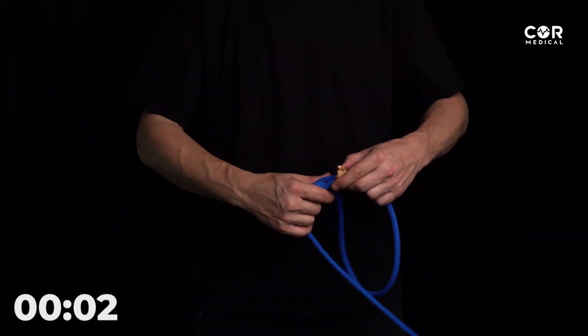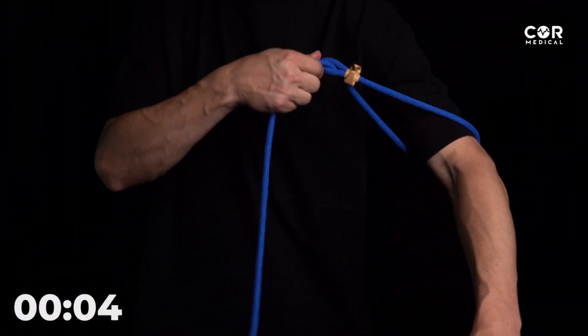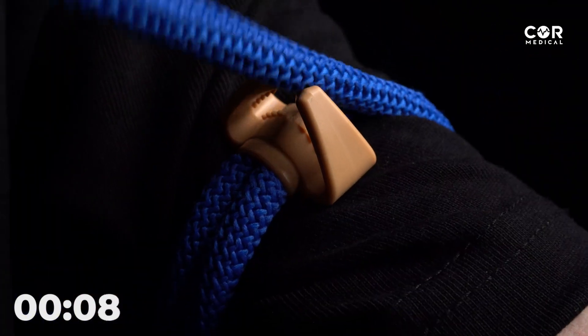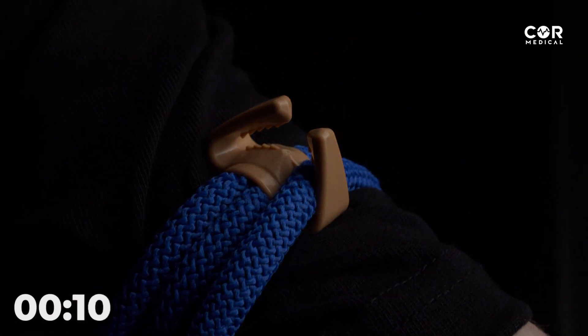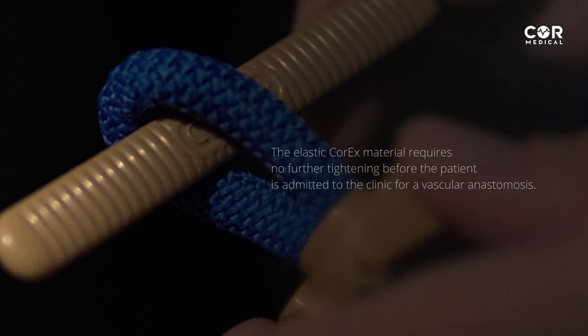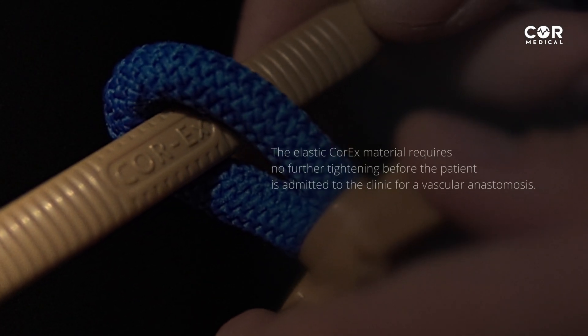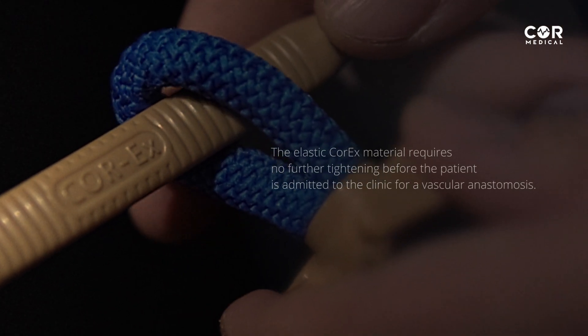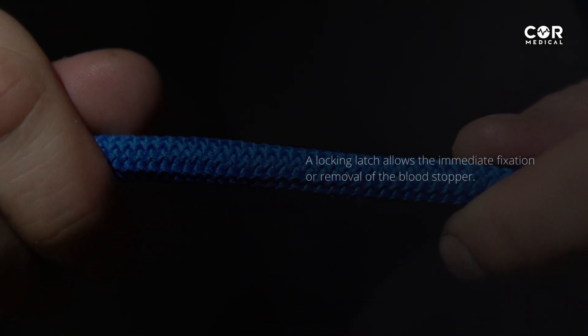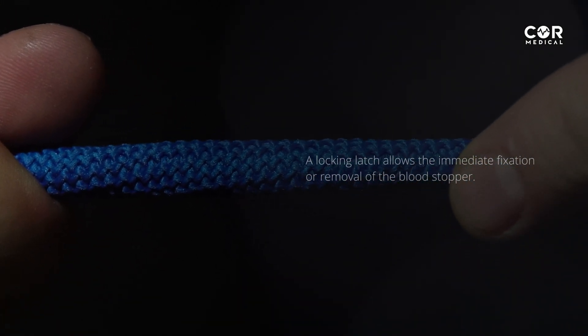Its main advantage over other analogs is overlay speed up to 10 seconds, due to its reliable intuitive design. The elastic Core-X material requires no further tightening before the patient is admitted to the clinic for vascular anastomosis. A locking latch allows the immediate fixation or removal of the blood stopper.